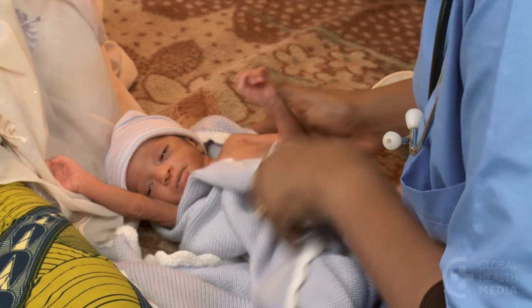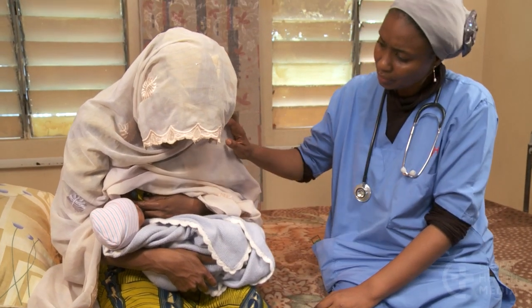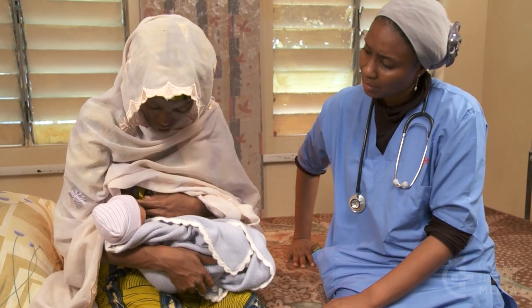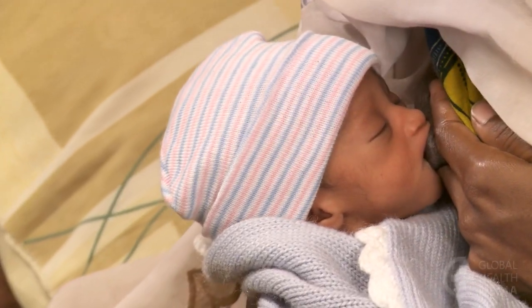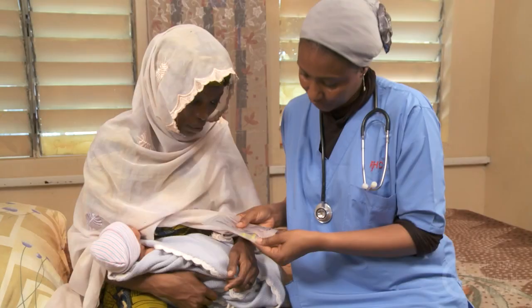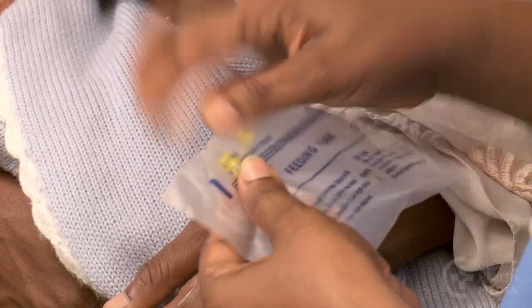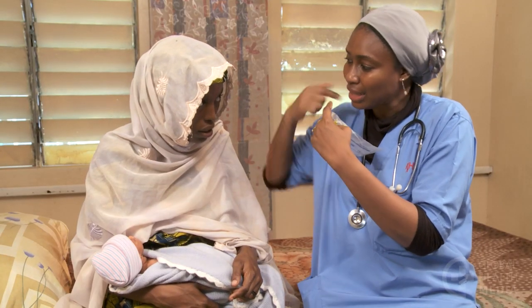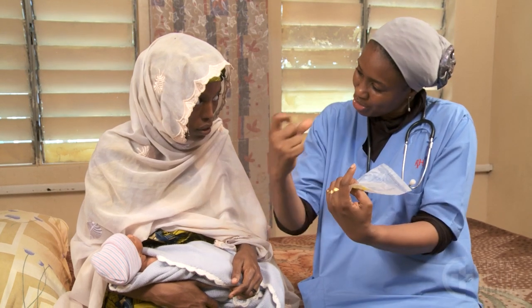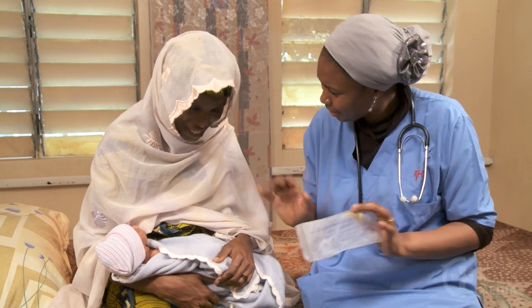This small baby was born too early. He's not yet able to breast or cup feed effectively. A gastric tube is needed until he's grown enough to suck and swallow on his own. Take the time to talk with the mother about the procedure and the need for it. Assure her that this is safe and will not hurt the baby.